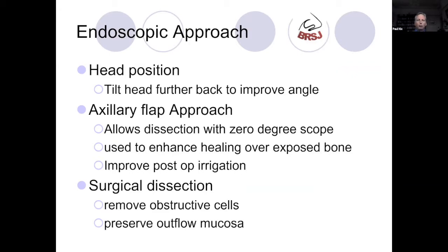So for a simple endoscopic approach to the frontal sinus, these are the essential bits from my point of view. In normal sinus surgery, I tend to have the head in a neutral position. If I know I'm going to be looking at the frontal recess, I tip the patient's head further back. That improves my angle to the frontal recess, and also allows instruments room so they don't hit the patient's chest.